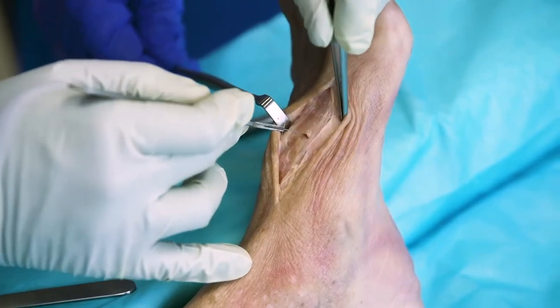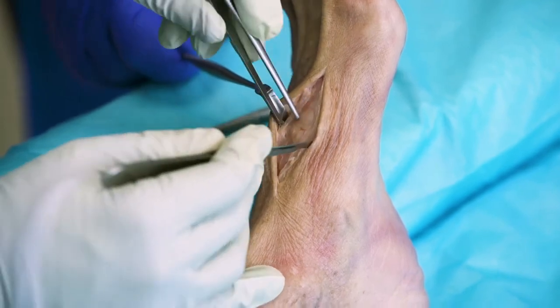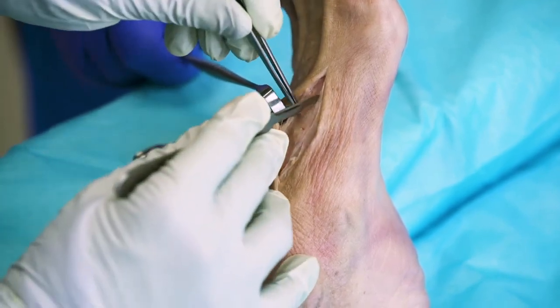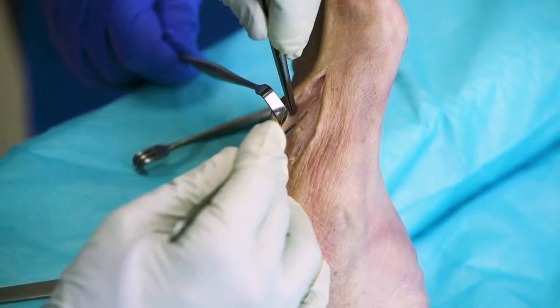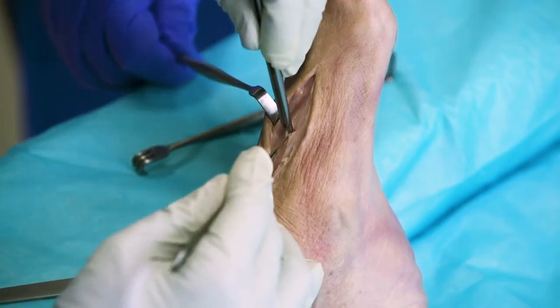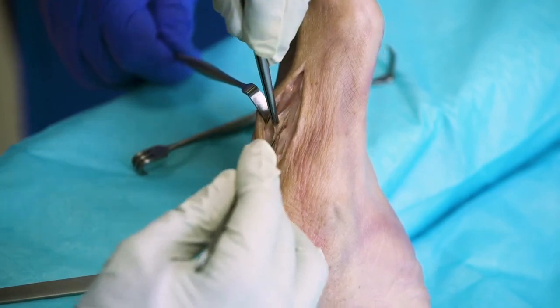The first tarsometatarsal joint is here. Once we have our area isolated, we're essentially right down to capsule and bone. We can begin subperiosteal dissection here to isolate the joint and preserve these tissues for later repair and closure.